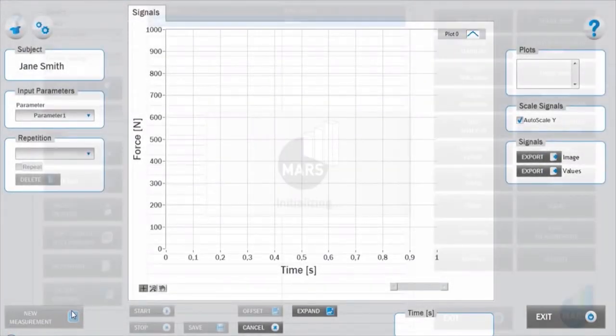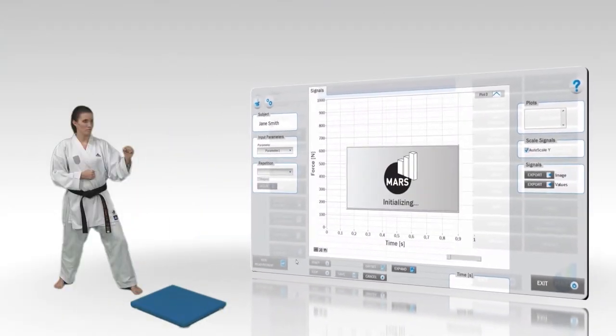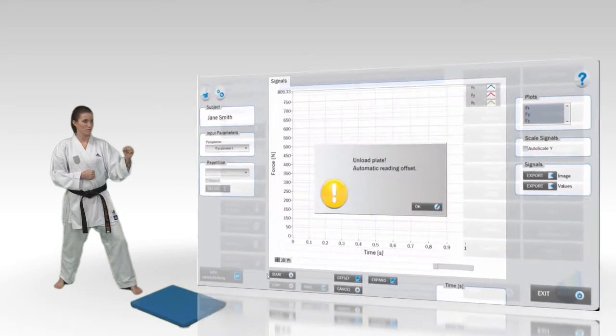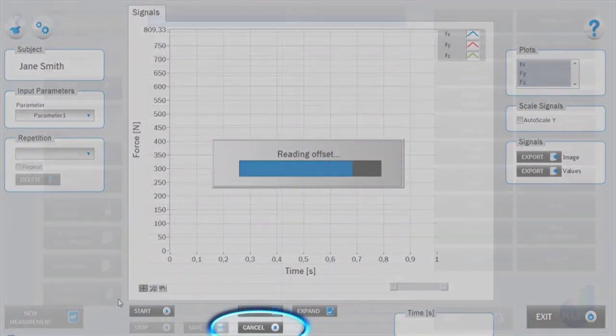After launching the test module and clicking the new measurement button, initialization and offset takes place. During this time the subject should not be on the force plate. If necessary, the measurement mode can be cancelled by pressing the cancel button.